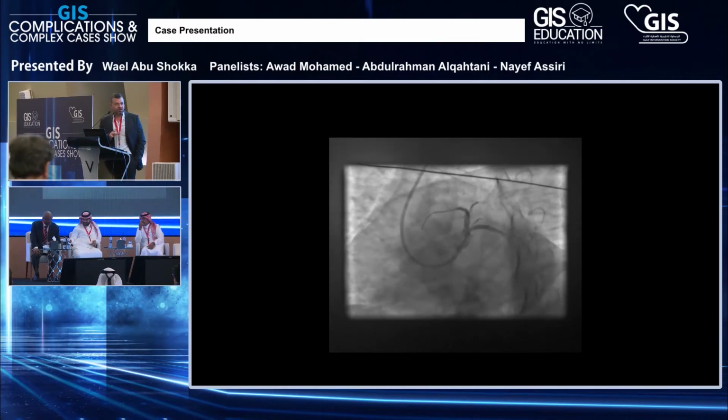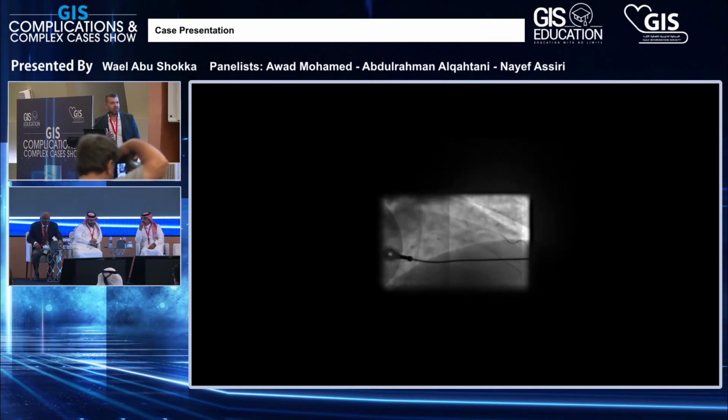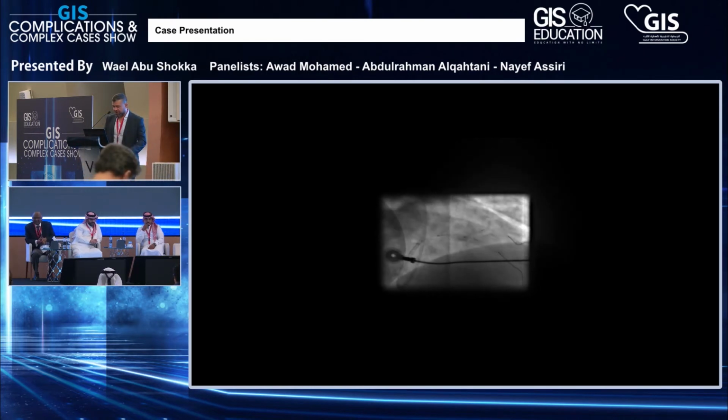Actually, we can go to the OCT. Sometimes you accept, with OCT, you see there was no edge dissection, Dr. Musa. We can go back.